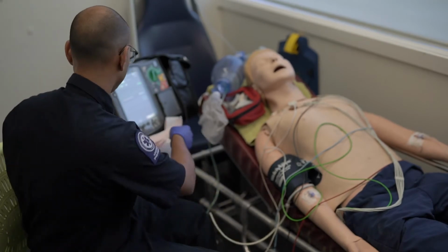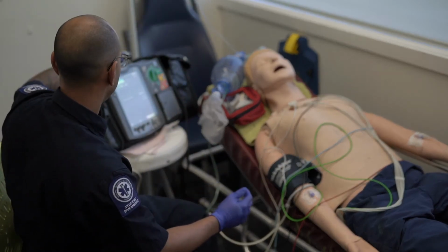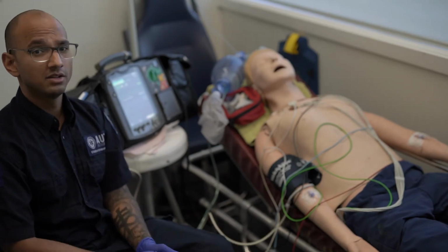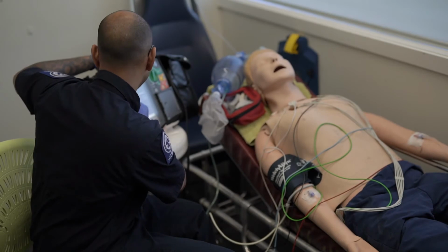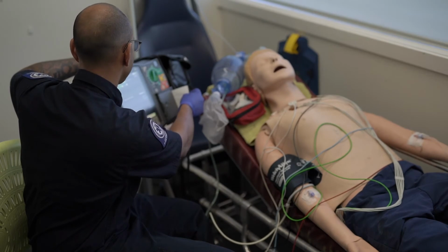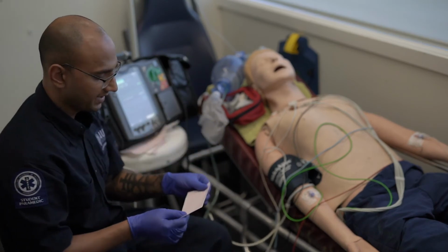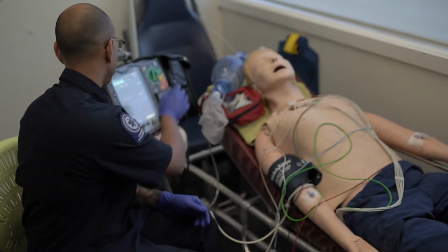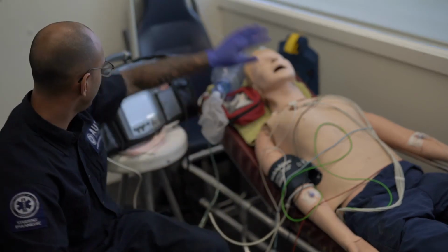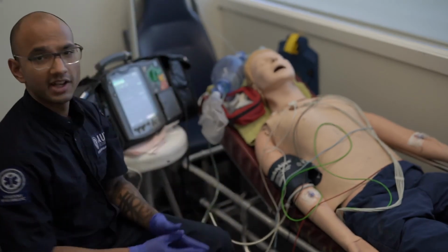If administering a second cardioversion, confirm the defibrillator is still in synchronized mode. We will now attempt a second cardioversion and confirm that our defibrillator is still in sync mode. Our defibrillator is still in sync mode. Just confirming one more time with another rhythm strip. Detection symbol above every QRS still present, and charging our defibrillator. I'm making sure everyone is clear, stand clear, pressing and holding the shock button. Our second shock has been delivered.